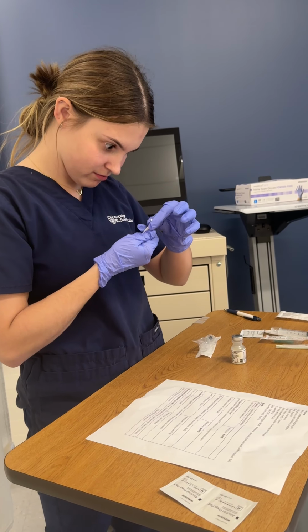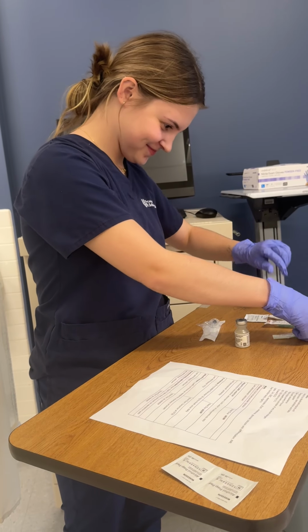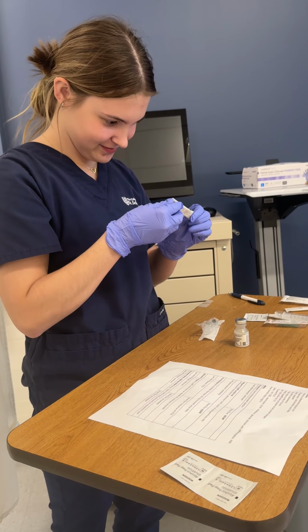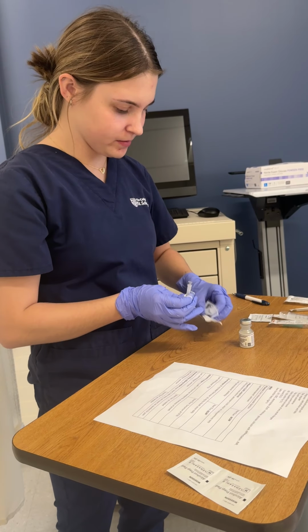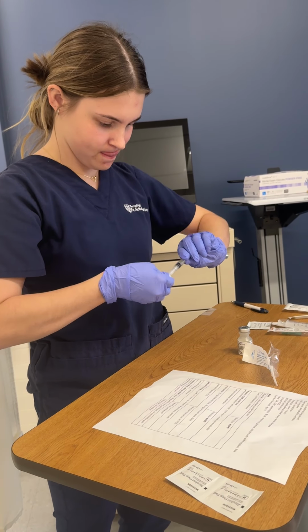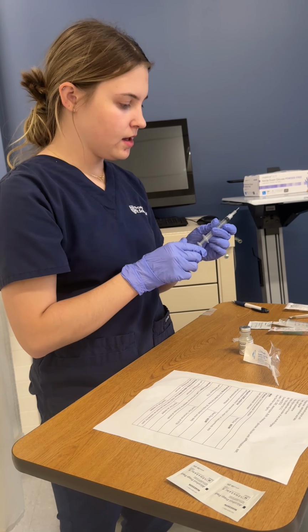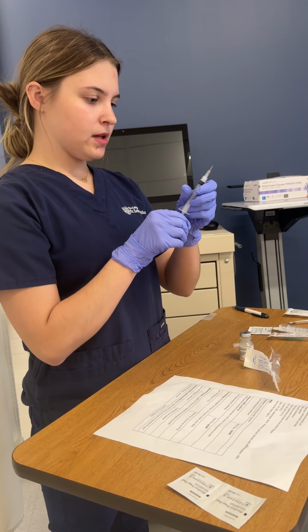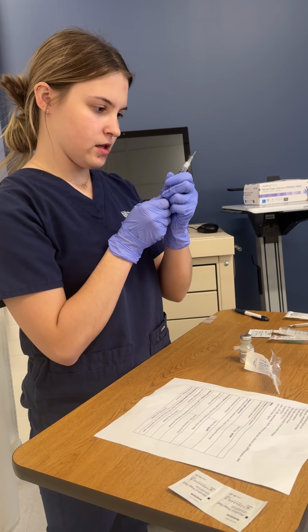If I can get it open. Okay, there we go. Okay, so now that we have our blunt tip needle open, you're gonna take the syringe and put it on. We're gonna take the cap off, and since it's 0.5 milliliters, we are going to want to inject that amount of air into the vial.